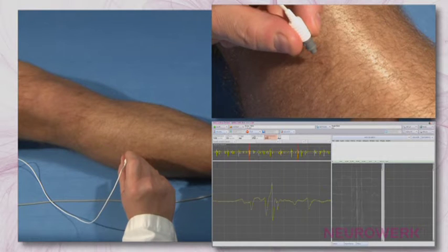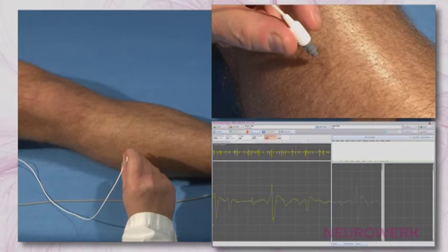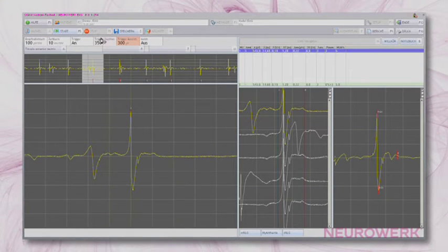If the patient activates the muscle too much or not at all, then it would be unsuitable to record and evaluate potentials of single motor units. The device can display single muscle action potentials in a triggered way and classify them by using various parameters. Therefore, a quantitative analysis of the potentials is possible. At least 3 muscle action potentials of one motor unit need to be recorded in order to accurately measure duration and amplitude.